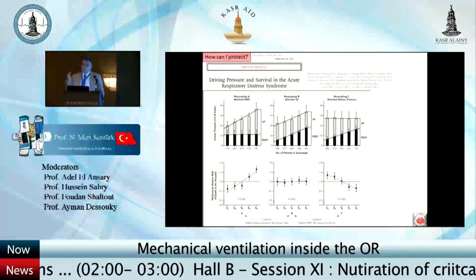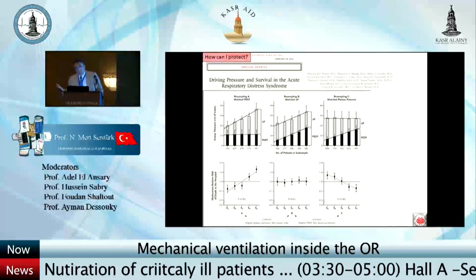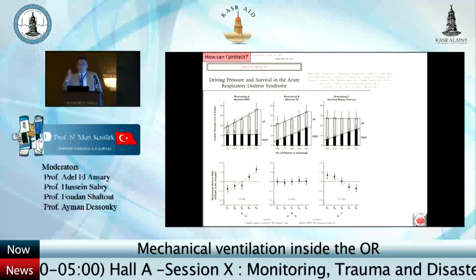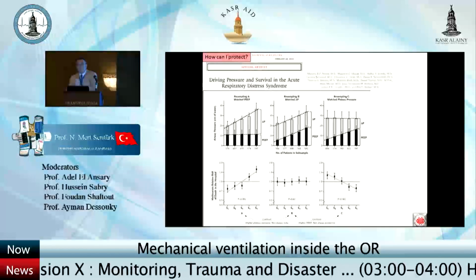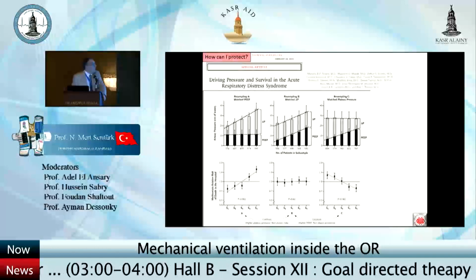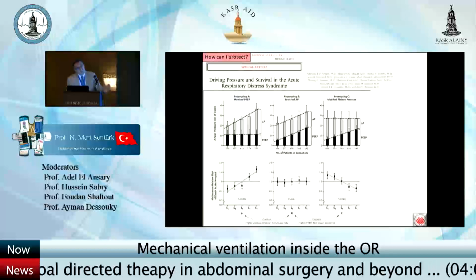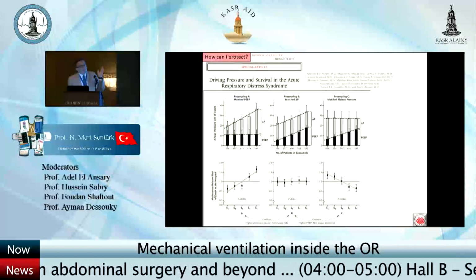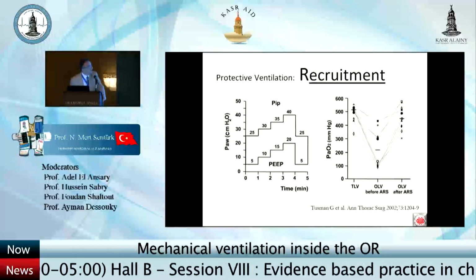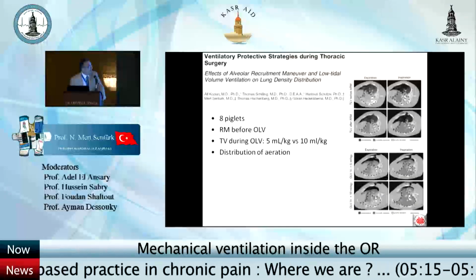PEEP can be good for lung protection, but in some patients it can also be bad for the patient. It is you, it is we, it is me, who would find the best PEEP for the patient. This is a famous study from Amato of 2 years ago, showing that it is actually the driving pressure which is the important one, which would prevent lung injury.